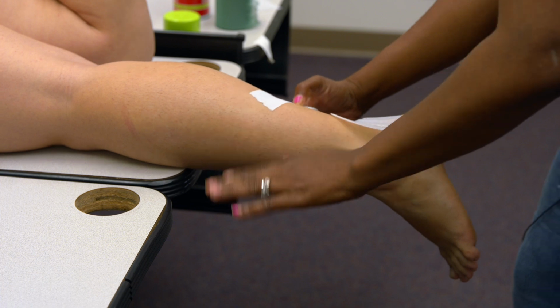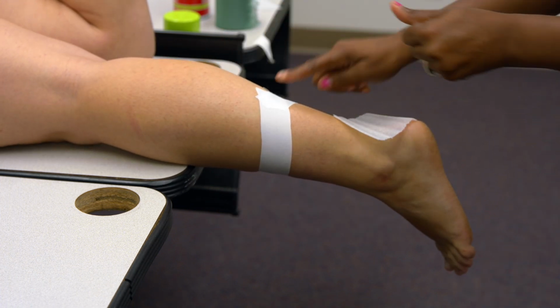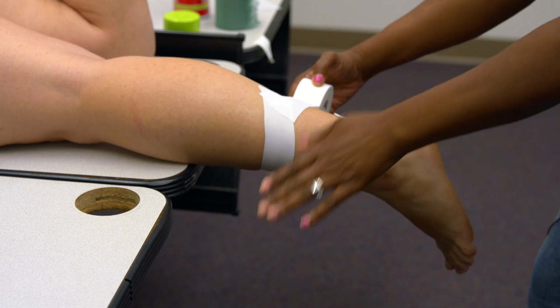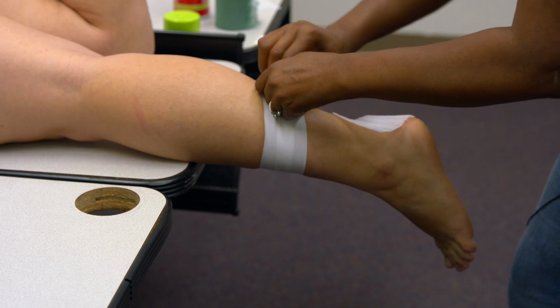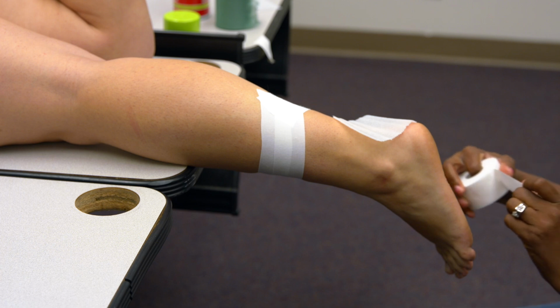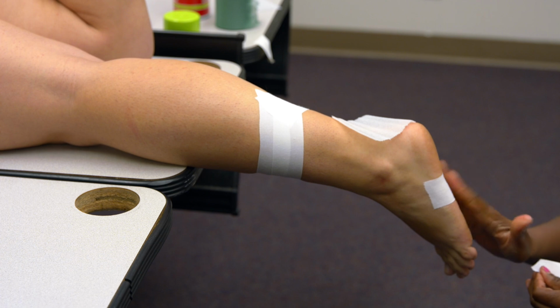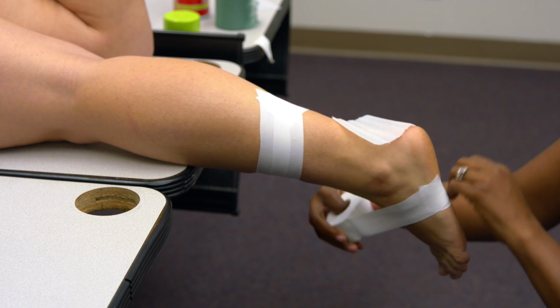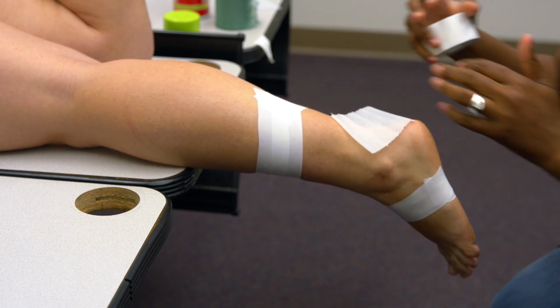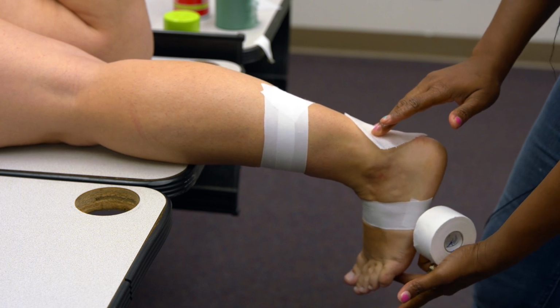So I'm going to start with proximal anchor strips, and I'm going to do 2 of those. Remember again, this is my first one, so I want to make sure there's a half lap between the 2. So this is going to be my second anchor strip. So I have 2 proximal anchor strips, and then we're going to do like we did in the ankle. We're going to do that distal anchor strip as well. So you can see that plantar surface of the foot, and then I'll just come on top and I'll do the same.